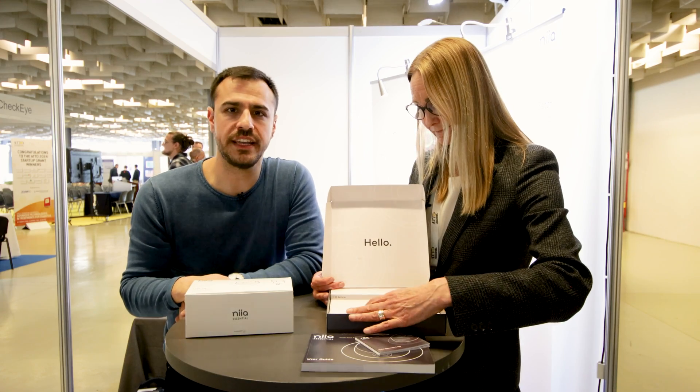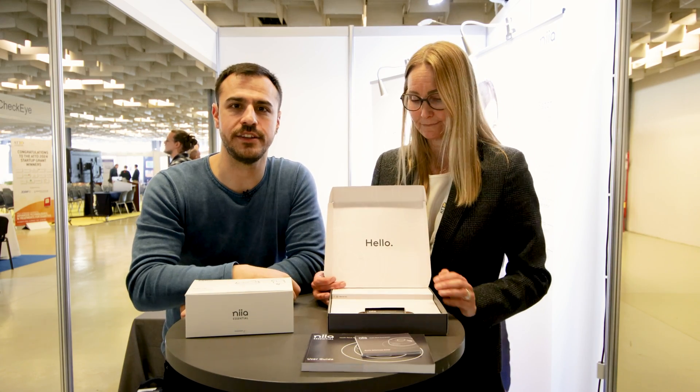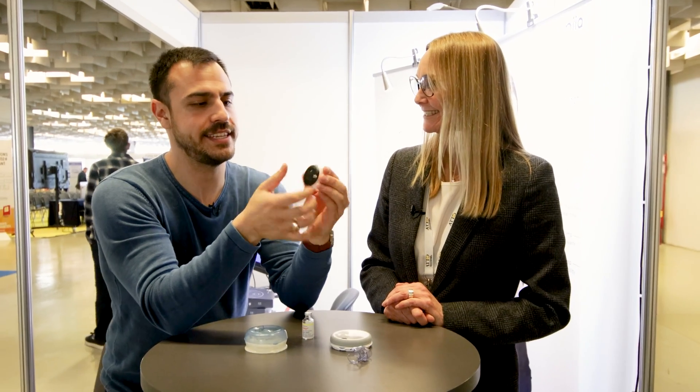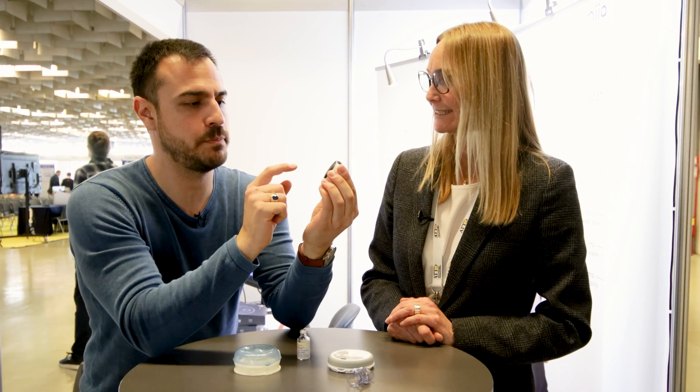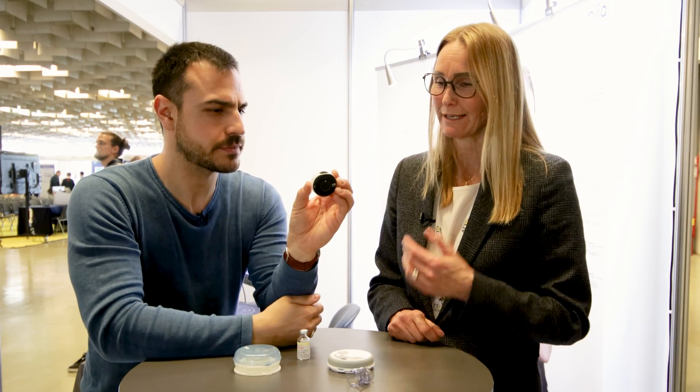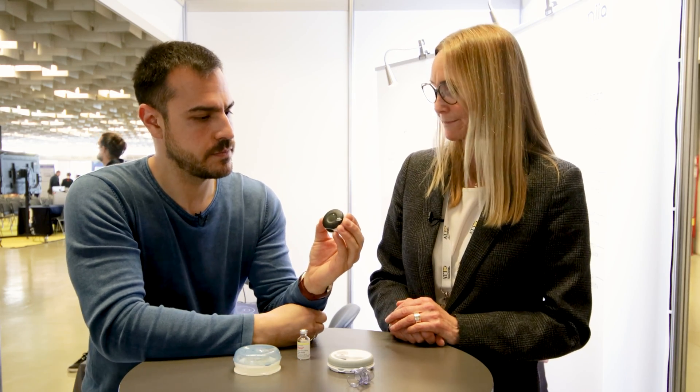We're going to do some movie magic and have all the filling stuff here in just a second. So tell us what we have here — can you explain each piece? This is the reusable part of the pump that you wear. It's two years for that one.